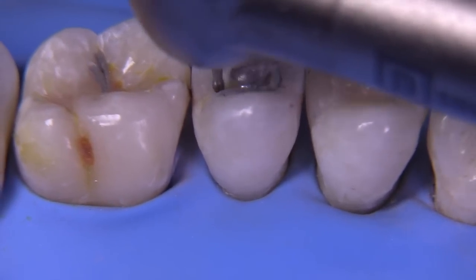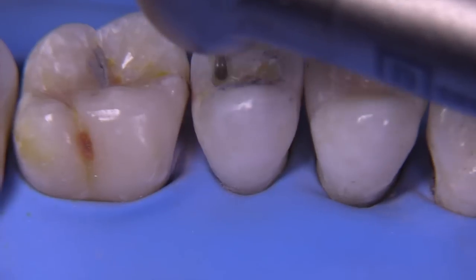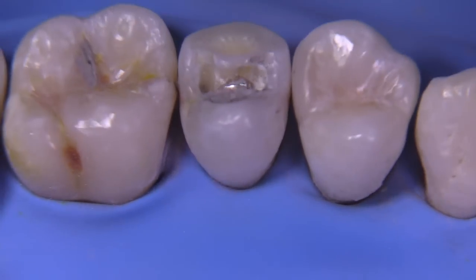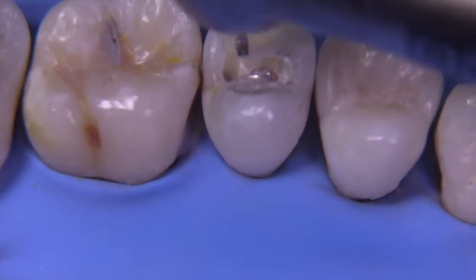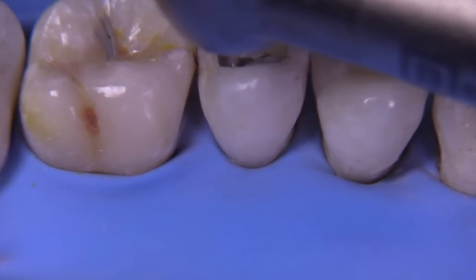I'm not going to go deeper pulpally at this point; I'm merely working on the peripheral areas. I like to establish periphery with the high speed before we get into the deeper zones, and usually that is done with a slow speed.